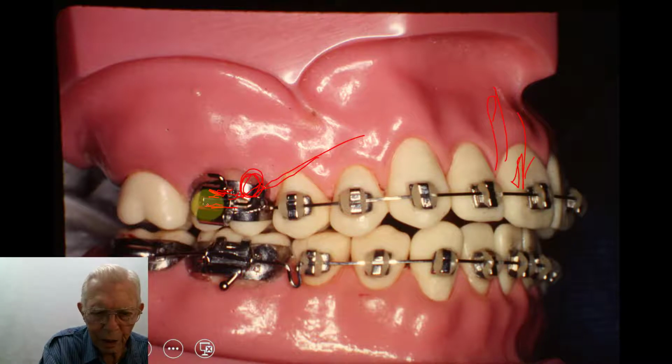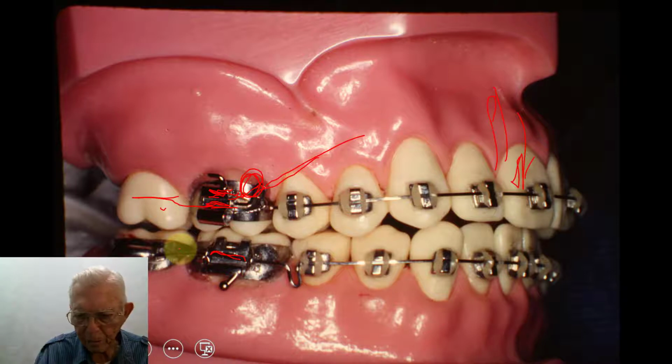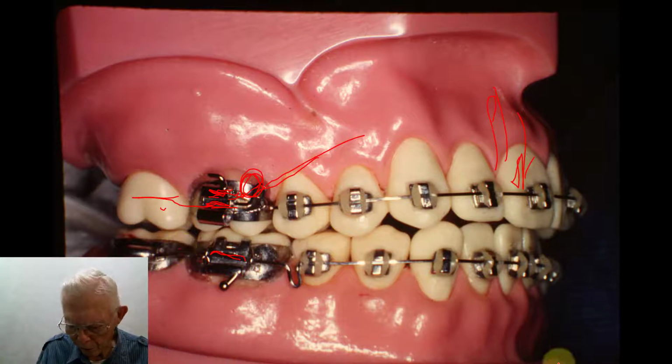This wire can be converted, and you can have a wire off. The 2 bands don't have to be the same. So we convert this tube right here. Down on the bottom we just have 2 slots for that. Let me get on into showing more of this.